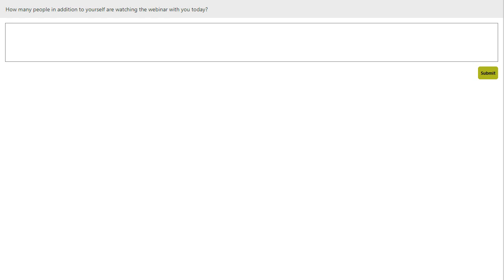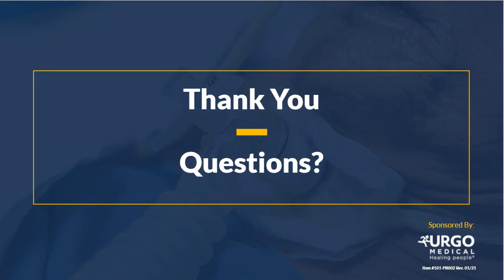That's a great question as well. At this point, we have figured out within our own facility what works for us. But the primary education that I provide anybody who's coming into contact with DrawTex the first time is to really assess the dressing itself. After all, we are trying to individualize care wherever we can. And in this particular case, every single patient produces their own volume of secretions. Some people produce none at all, and others will drain copiously.